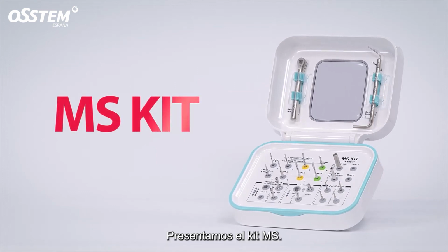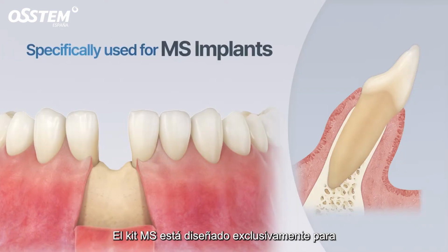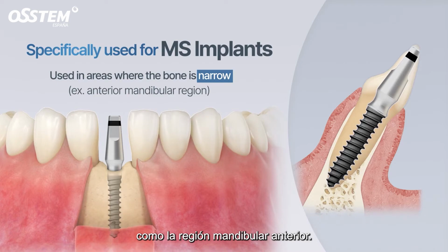Introducing the MS Kit. The MS Kit is designed exclusively for MS implants, which are used in areas where the bone is narrow, such as the anterior mandibular region.